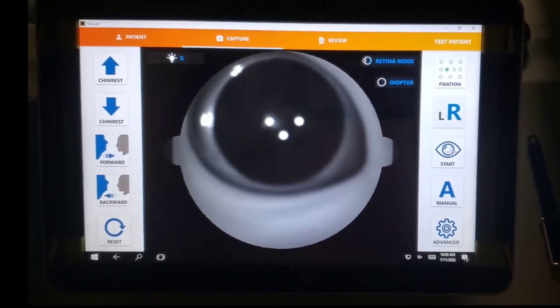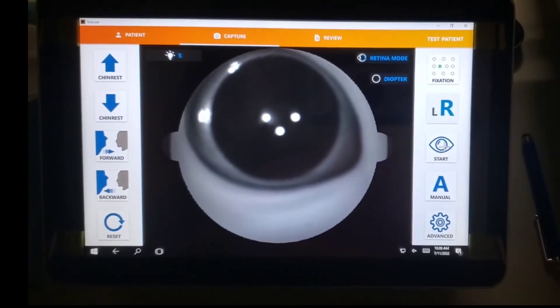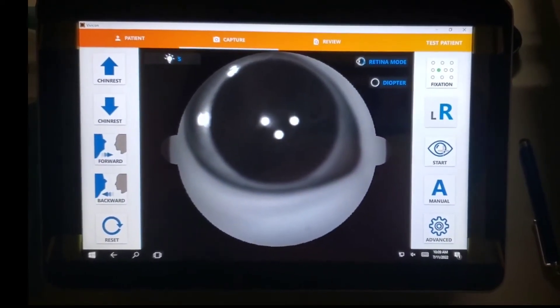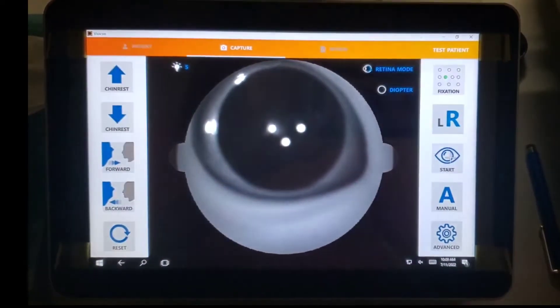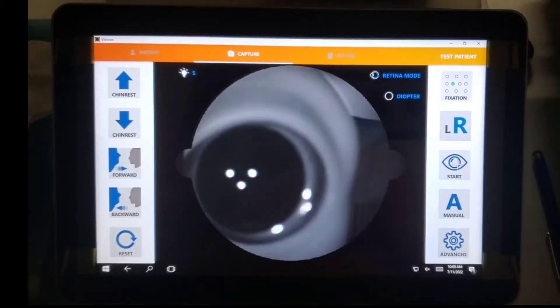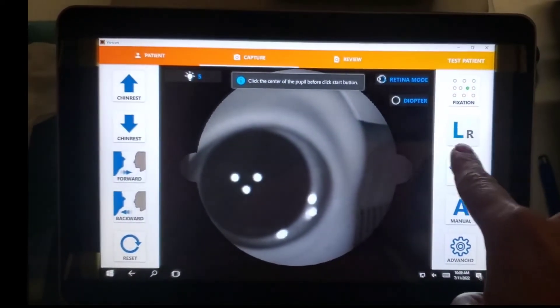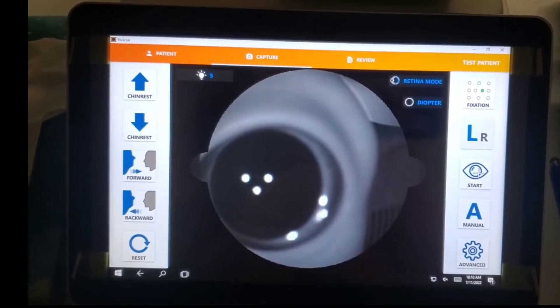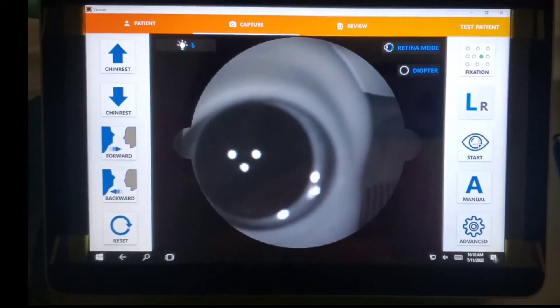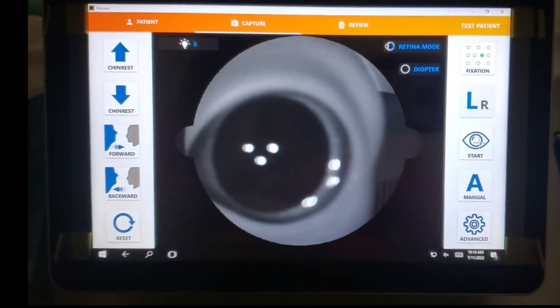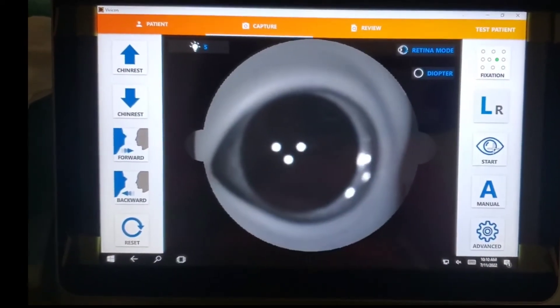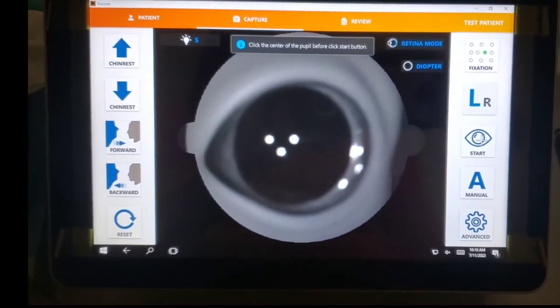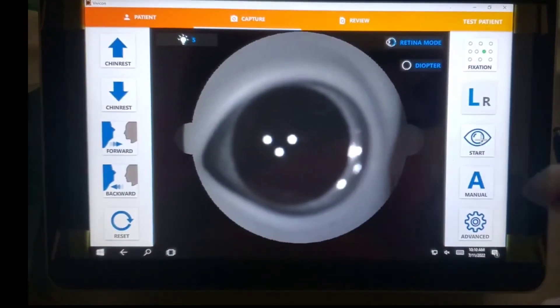When you're done with the right eye and we know that the photo turned out good, there's no blinking or eyelashes in the way, we can go to the left eye. We're going to click this button and the machine will move itself over to the left eye. We can see that the L is now highlighted in blue. So we can see the patient's eye is a little bit off. We can actually click the center of the pupil. That's going to better align the machine before we take the photo. Once they're lined up, we can hit the start.